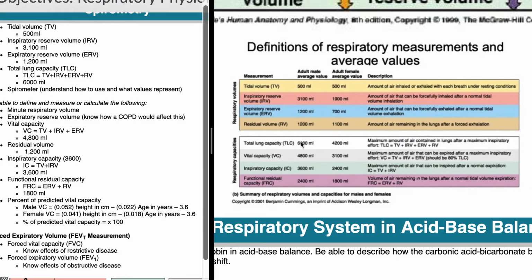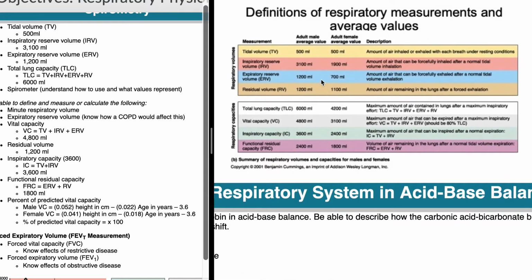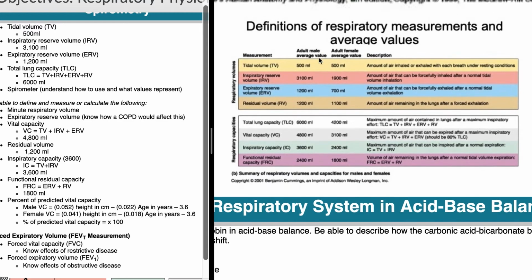And the reason it's relevant is that if someone's sitting in front of you and they are phenotypically female and they are 6'7", you should still take into account that they may fall somewhere between these two numbers here. And so those two values, the height and their muscular development, are going to be the big things here. And these are just kind of your averages, taking the average male, the average female, and comparing them. But that's where you see the differences.